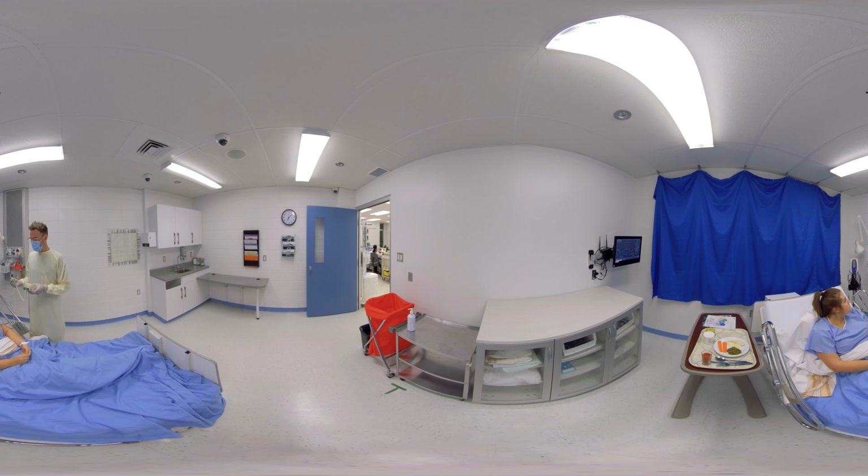So I'm going to go ahead and take your oral temperature. I'm going to ask you to open your mouth. And I'm going to put this under your tongue. If you just close your mouth, and let's see what pops up here. Yeah, perfect. So 36.8. So the good news is your temperature has gone down. Okay, that's great. It's good to stay positive like that. So I'm going to go write that down in your file. I'll be back in 1 hour. In the meantime, if you need anything, feel free to push on the help button and someone will come and see you. Okay, thank you.